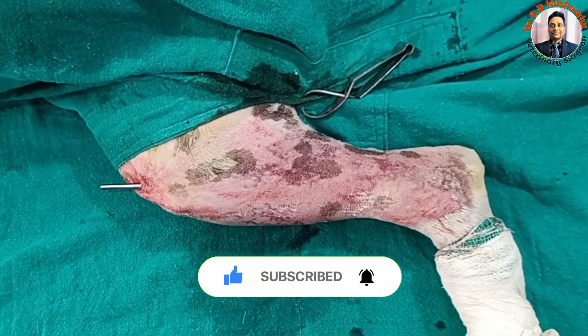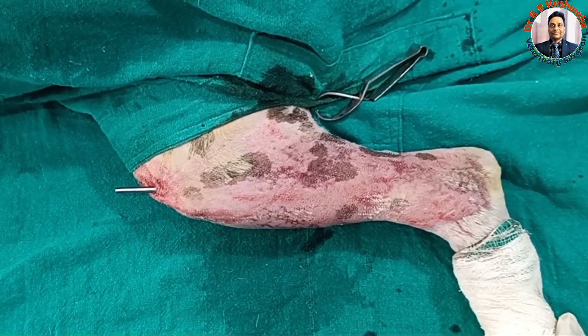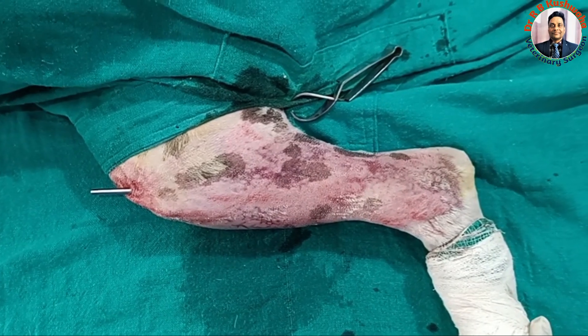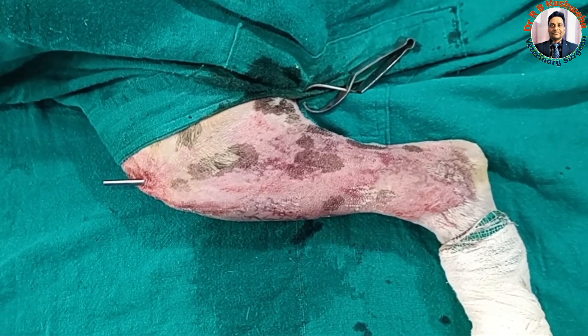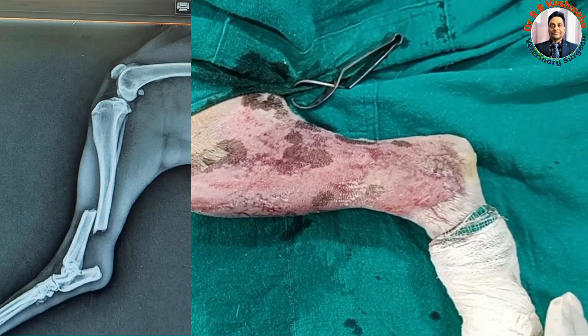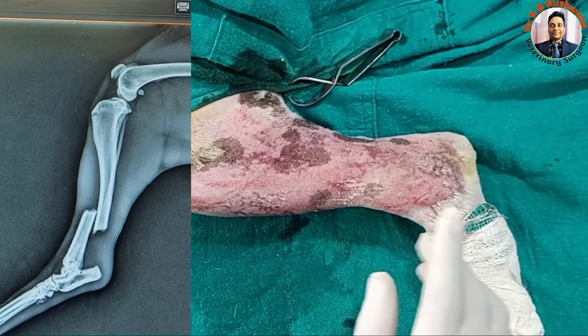Today we have a case of distal one-third diaphyseal fracture of the right tibia in an adult stray dog. The history is that the dog had the fracture three days back, probably by a stick injury. We took the radiograph and confirmed this is a distal one-third transverse fracture.